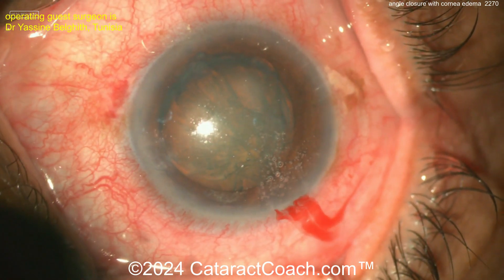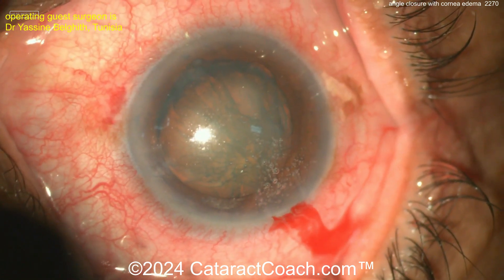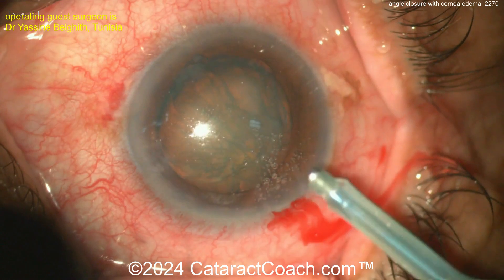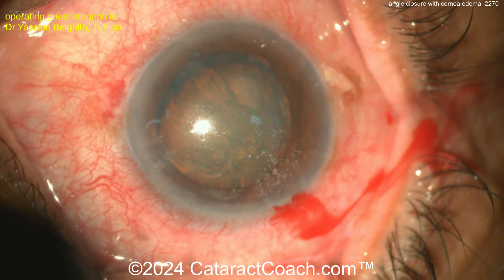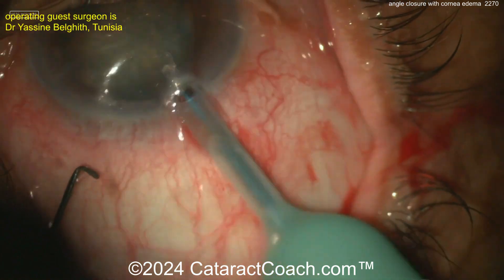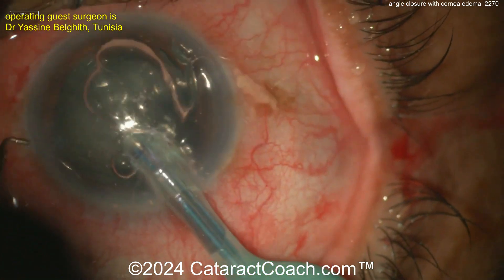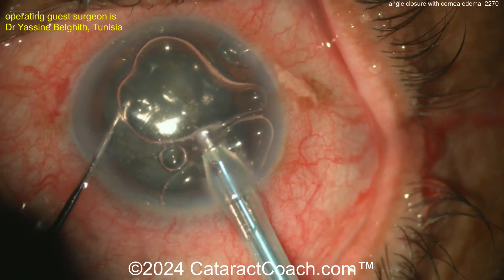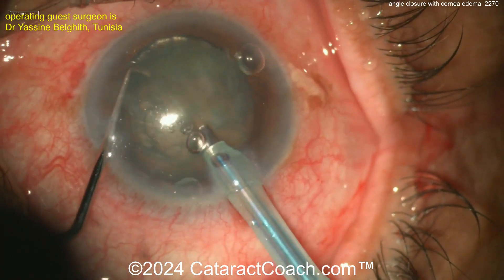In a case like this, you certainly want to do the cataract surgery. Look at the cornea — it's still edematous. Here's the magic of this video: by the end of the video, because of the normal IOP during surgery, the cornea is going to start to clear up — even during a five or ten minute case.